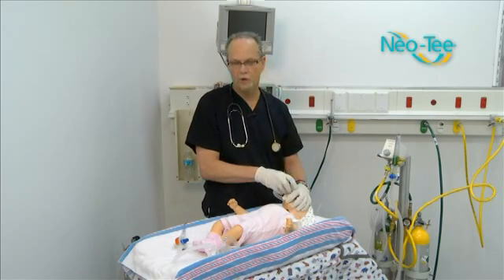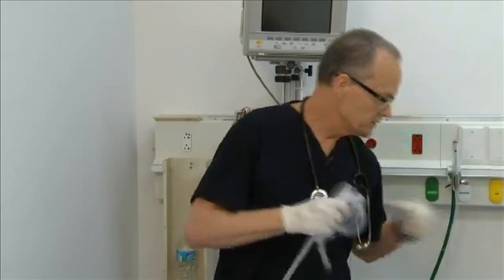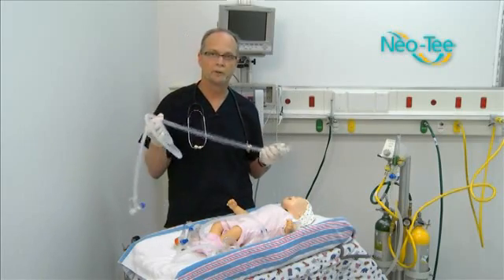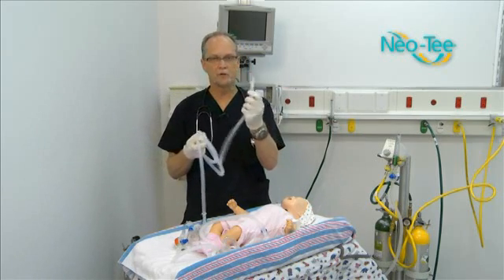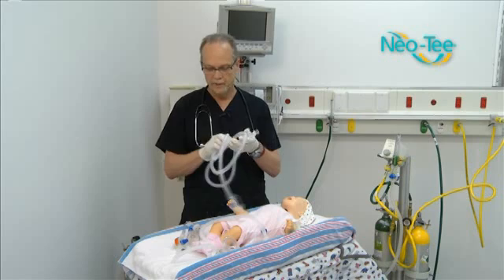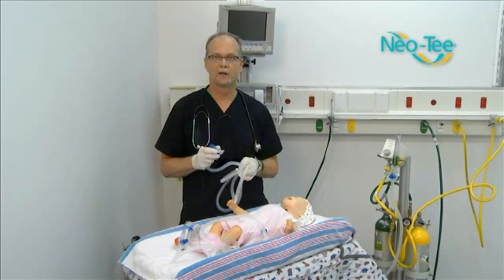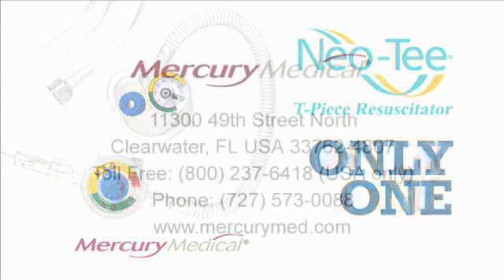We also have some additional NEO-T products that do not have a PIP controller or a pressure gauge. These are designed with a universal connector to go onto capital equipment you may already have, but they do provide the T-piece and PEEP functionality for ventilation. Thank you for your interest in Mercury Medical's NEO-T Infant T-Piece Resuscitator System — the only one. For more information, contact Mercury Medical.